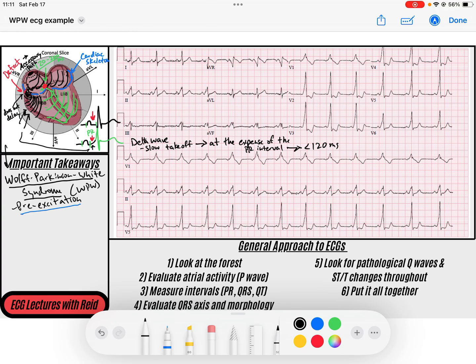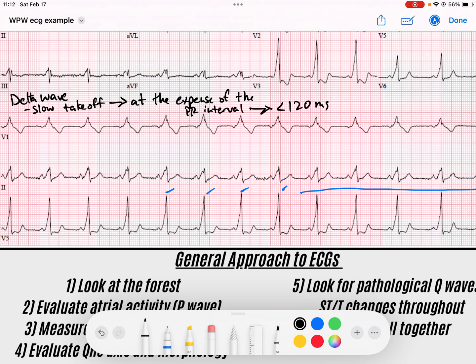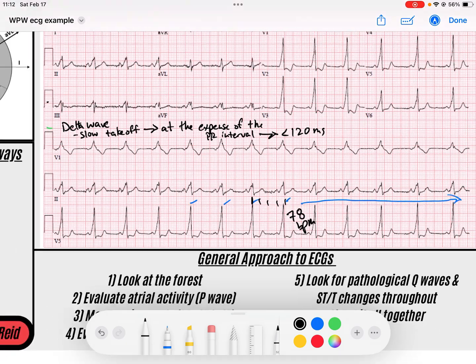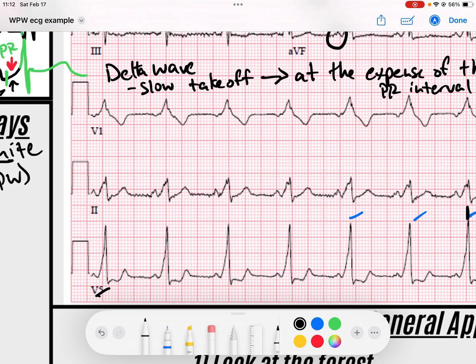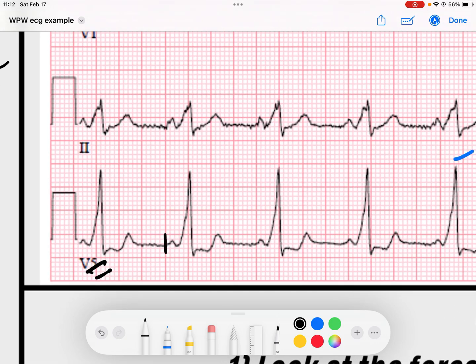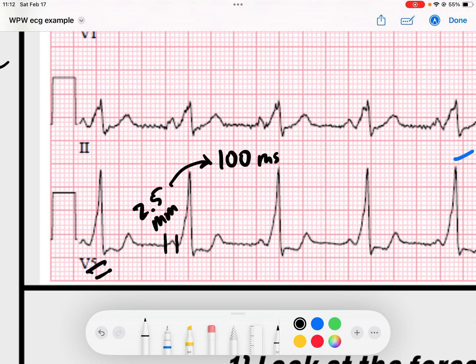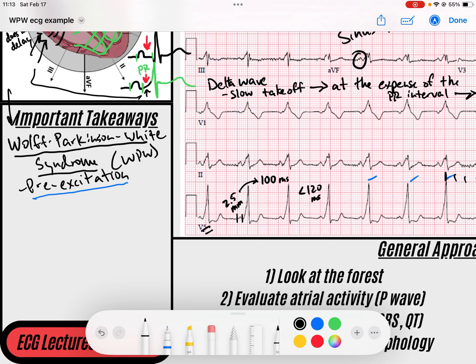Let's look at what that looks like on this ECG. We've got a rhythm that is quite regular throughout the entirety of this strip. The rate looks to be about 78 beats per minute. I can see P waves in front of my QRSs — upright in lead 1 and upright in AVF — so these are sinus node-generated P waves. When I measure the PR interval, coming down to V5, looking from the beginning of the P to the beginning of the QRS, that's about 2.5 little boxes, which is 100 milliseconds — less than the 120 milliseconds lower limit of normal.